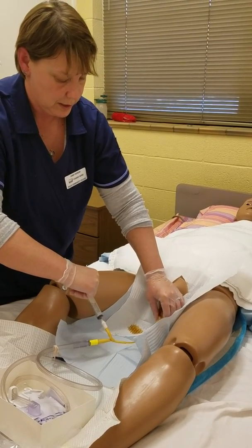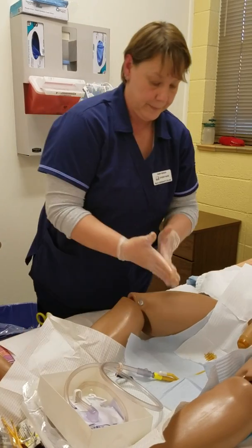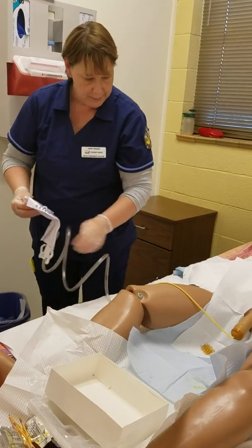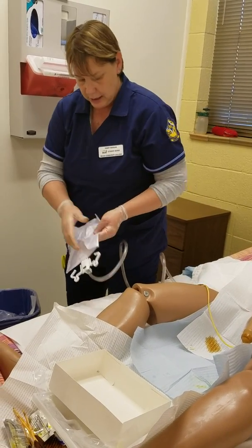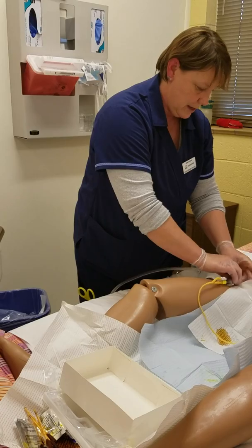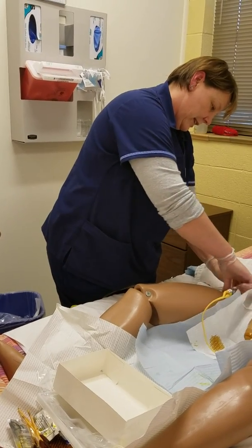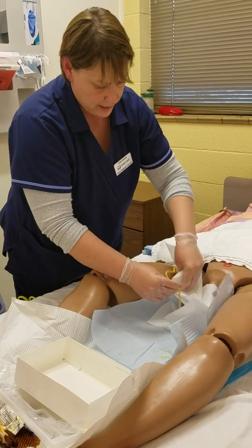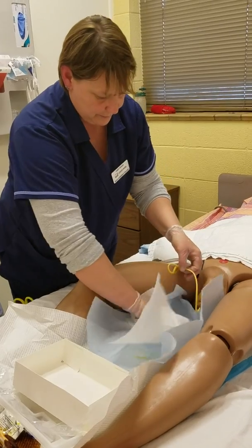Once I see urine and have advanced the catheter appropriately, I'm going to go ahead and fill the balloon, keeping track of how much saline from the syringe I actually put into the catheter. Once that's done, I'm going to grab the collection bag and set it at the end of the bed. Then I'm going to tape the catheter either at the top of his thigh or at the lower abdomen. Once that's all done, I'll go ahead and clean up.